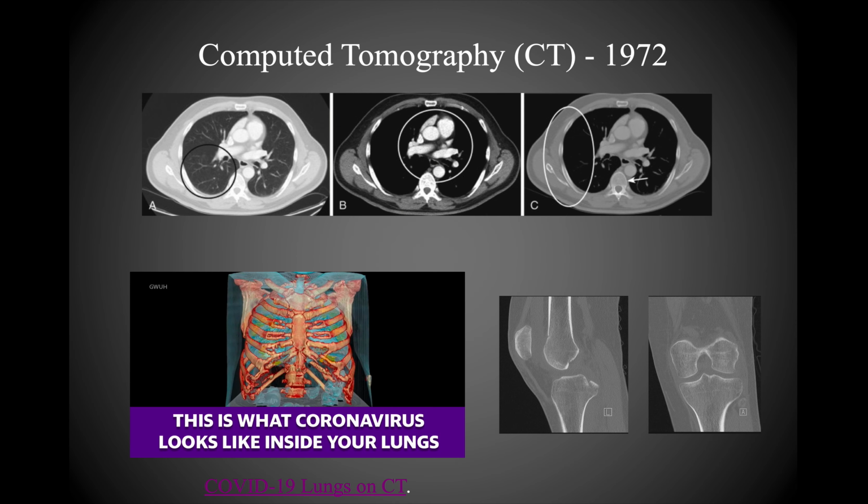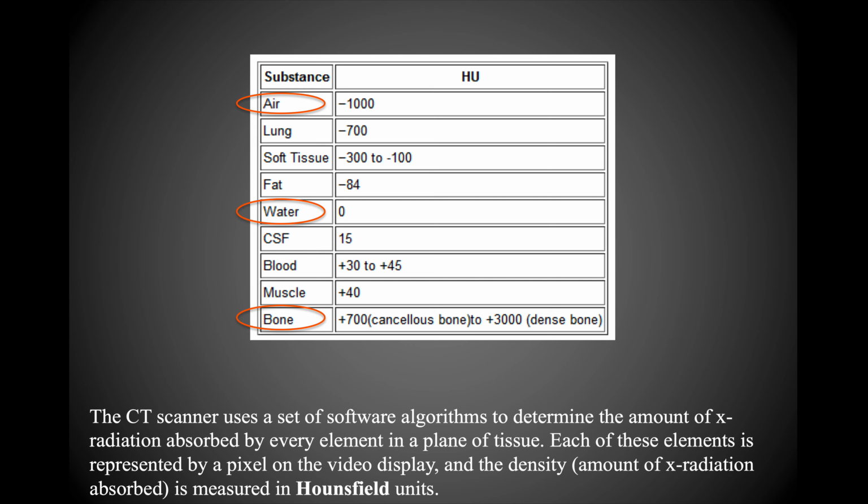So that probably leaves you wondering, why in the world do we still use conventional X-rays? Why are they 75% of the radiological scans that are performed if CT is so much better from a user perspective? The reason is that CT exposes patients to 10 to 100 times or more the ionizing radiation that a conventional X-ray scan does. It's an immense amount of radiation that a patient is exposed to with a CT. And since CT scans are based on X-ray beams, the appearance of tissues on CT is basically the same as for X-ray studies.